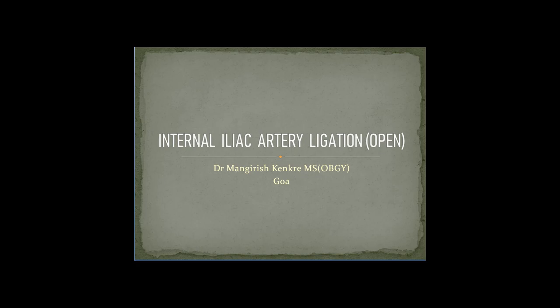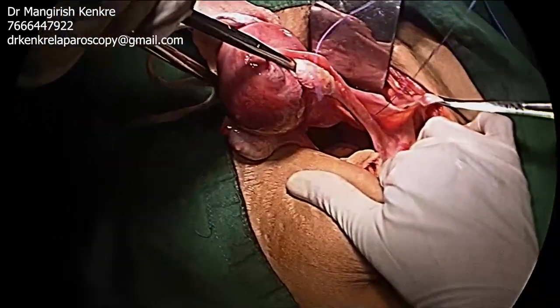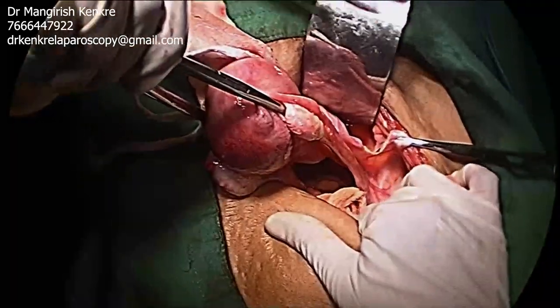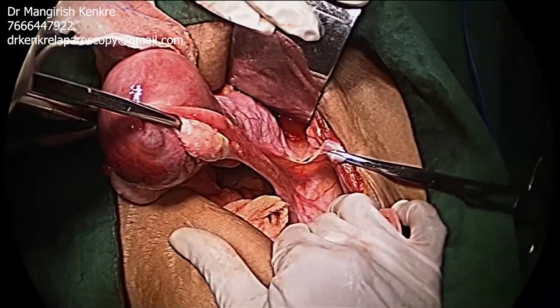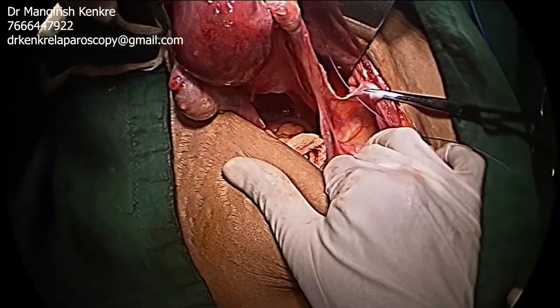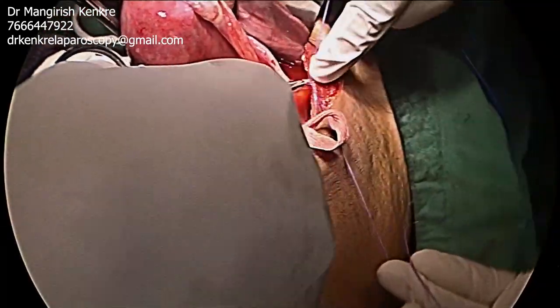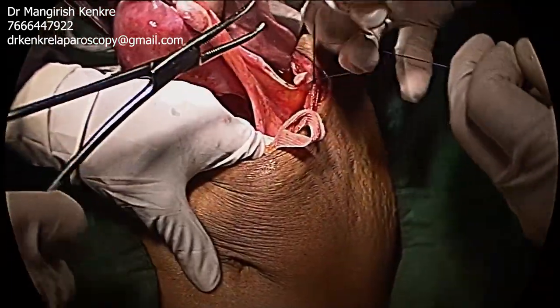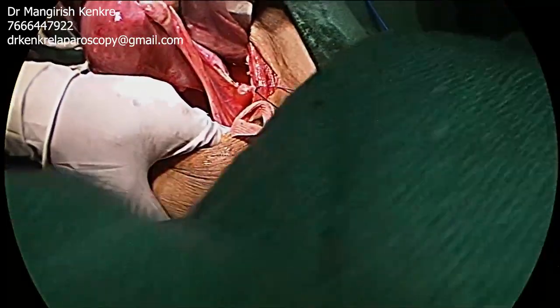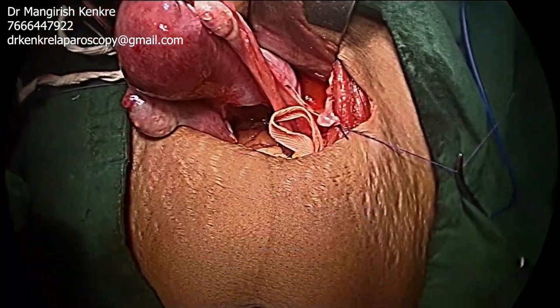This video demonstrates the ligation of the anterior division of the internal iliac artery via the open technique. The uterus is kept under traction by the assistant. The round ligament is cut and its distal end is held using a polygalactin suture. The round ligament is then placed under traction.